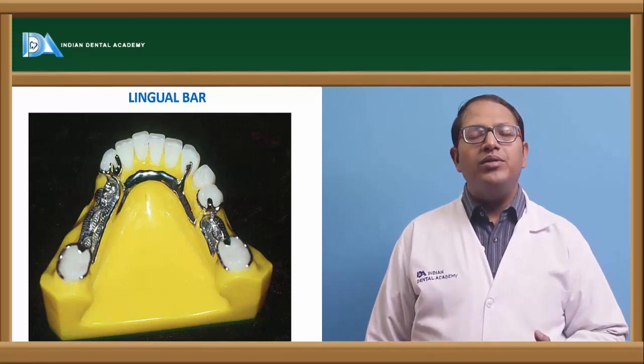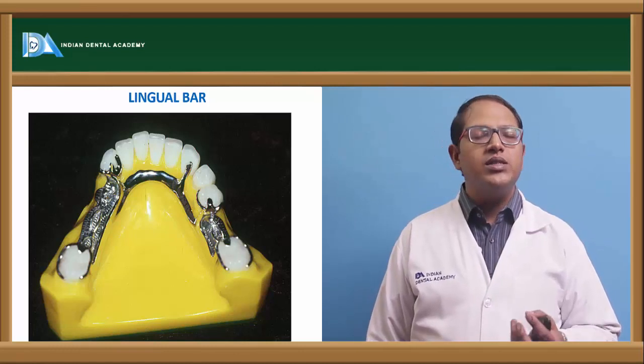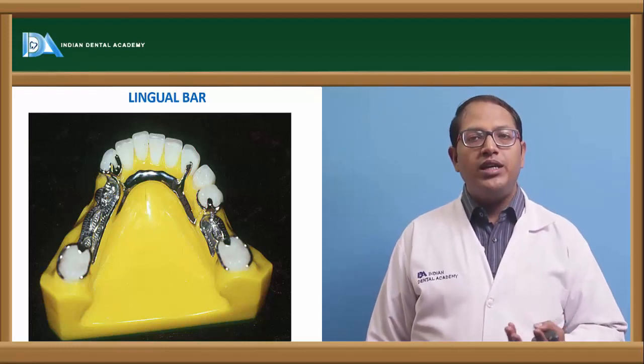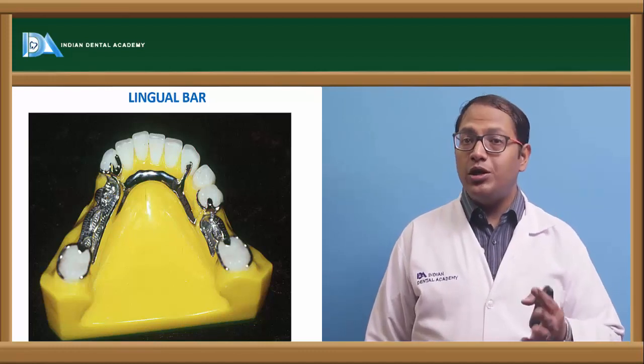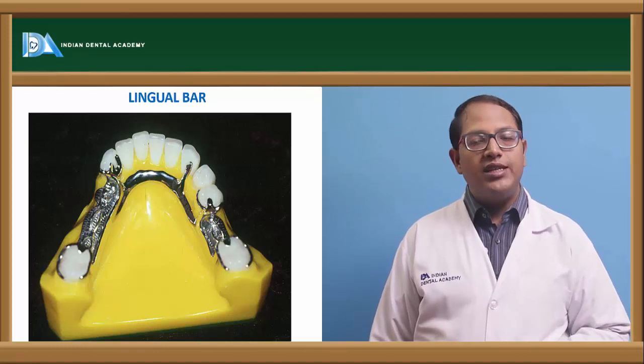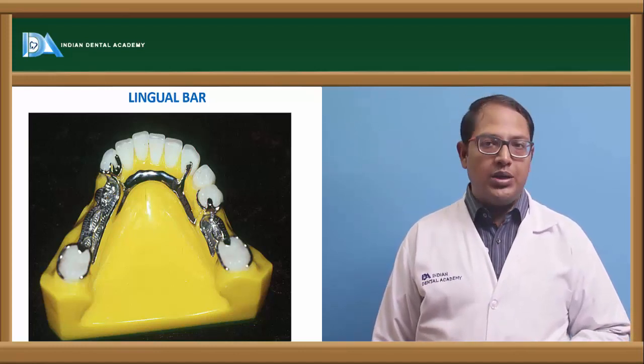So now where are we supposed to use this lingual bar? It is very simple in its design. We can see it's very simple in the design. So where all can we use it? You can use it in all tooth supported, not tooth tissue supported, but tooth supported, removable partial dentures. All of them can be given a lingual bar.